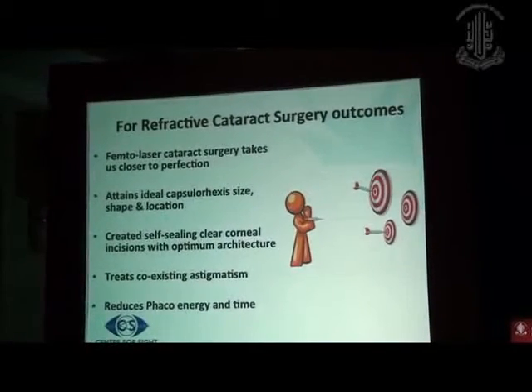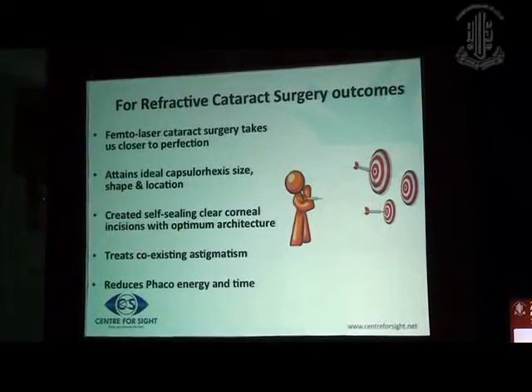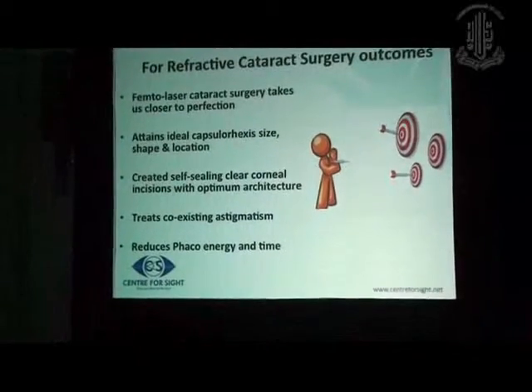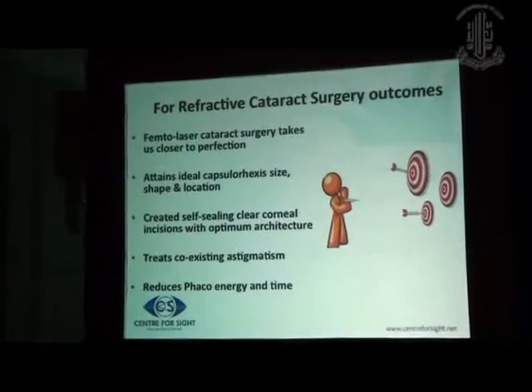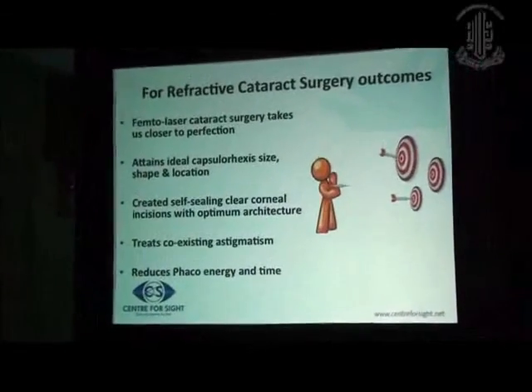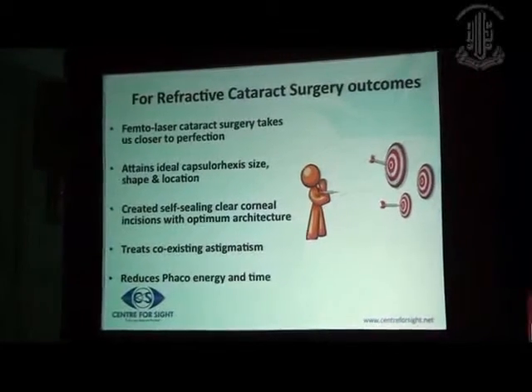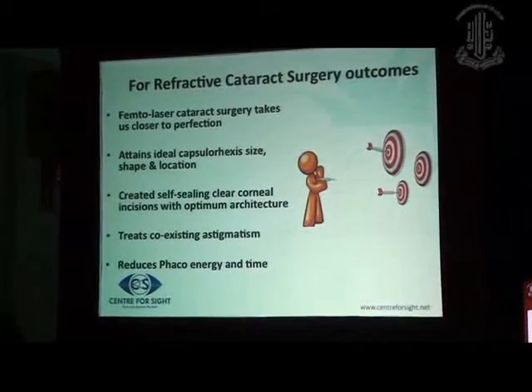It is the same machine, the heart of the machine is the same, only the numerical apertures change so that you focus on different layers on the cornea. And friends, femtosecond cataract surgery or a cataract refractive surgery is becoming rapidly the gold standard for premium IOL surgeries in the Western countries. There are more than 550 installations of the femto in the world, and there are more than 3 lakh procedures of femto cataract that have been done. So in India, I think there are more than 22 installations. In Delhi alone, I think there are 6 installations now of the femto cataract.